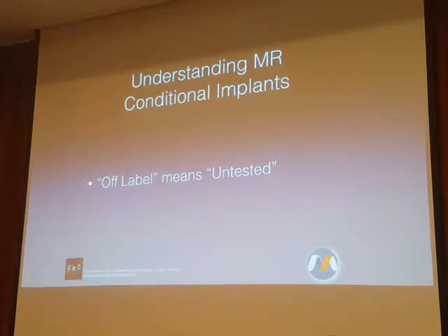And somebody out there says, well, we have a whole bunch of these patients who have this implanted device. I really think 0.2 watts per kilogram is absurdly low. What happens if I image these patients at 0.5? And so somebody will image 20 patients at 0.5 and they'll test the implanted device and they'll check on the patient and they'll see there were no adverse outcomes when I scanned these 20 patients at 0.5, and they'll publish a paper.